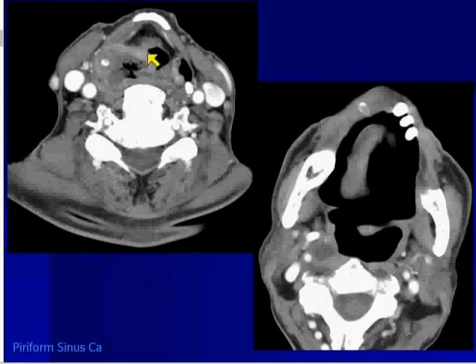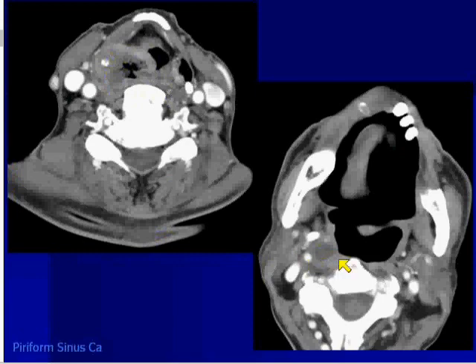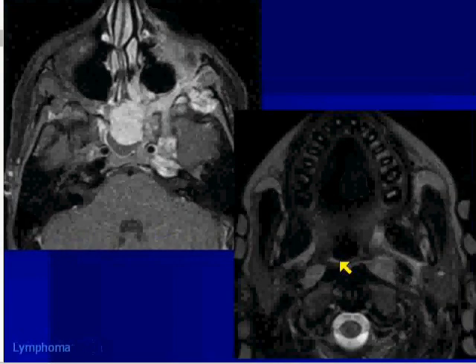Here's a patient with a hypopharynx cancer. This is clearly an abnormal right piriform sinus. This person has lateral retropharyngeal lymphadenopathy with a node interposed between the internal carotid artery and the longus coli, longus capitis muscle.